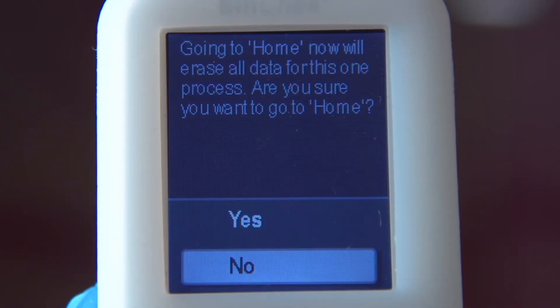If you return to the home screen in the middle of a reading, you must restart the measurement process.